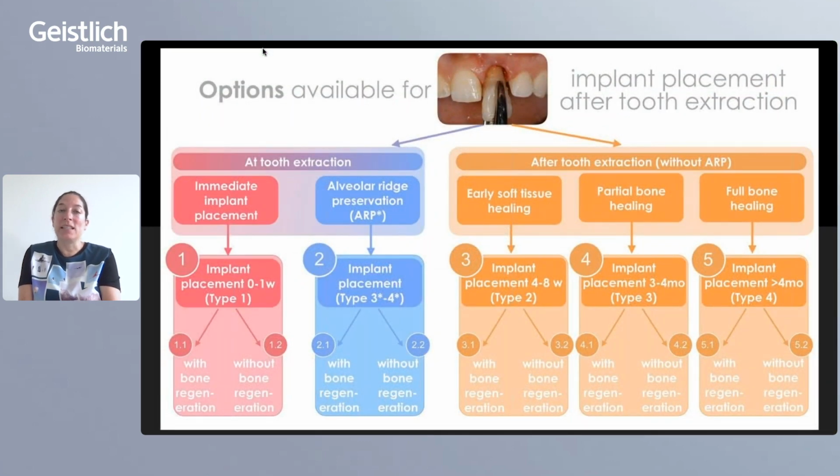Again, I leave you with this scheme of the options that you have when doing a tooth extraction and when planning an implant placement later on.